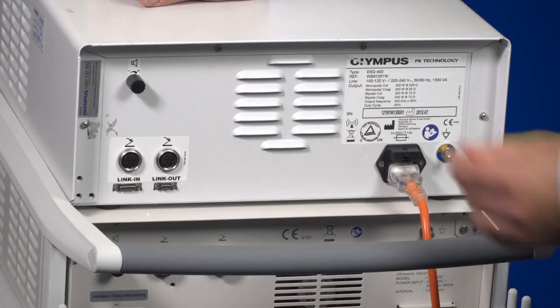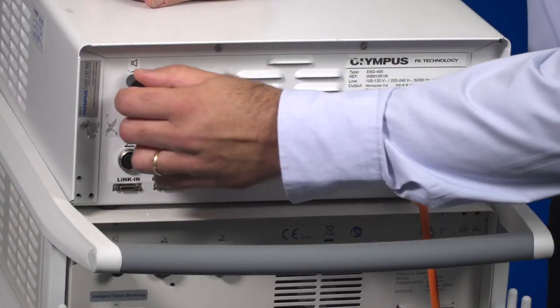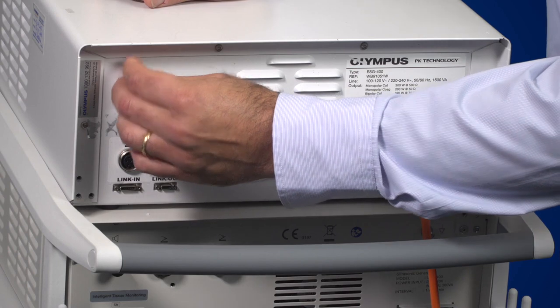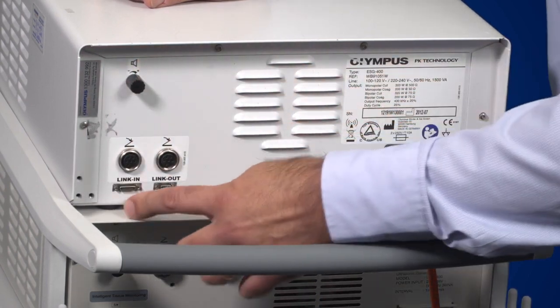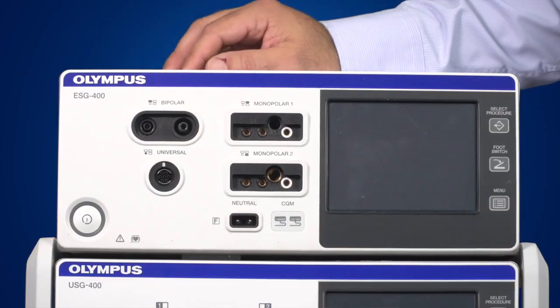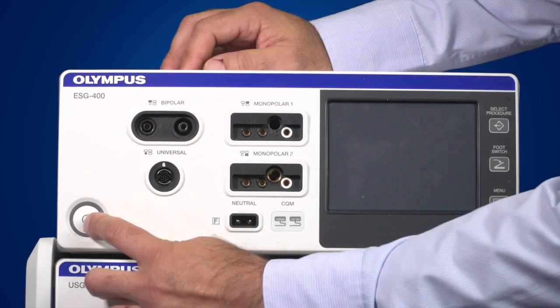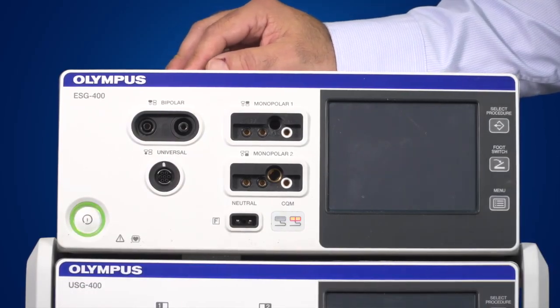On the rear of the generator, you have two footswitch sockets, a volume control knob, ventilation holes and both a link-in and a link-out socket. To activate the generator, simply press the power button. You'll see that it powers up quite quickly and the graphical user interface is activated.